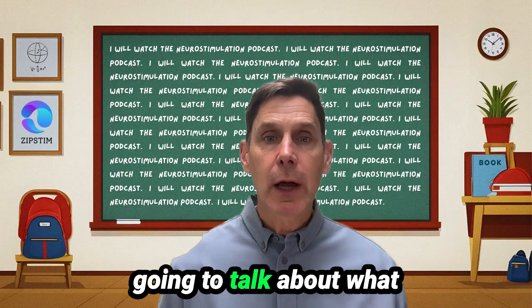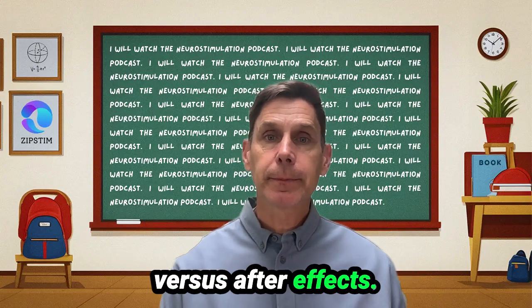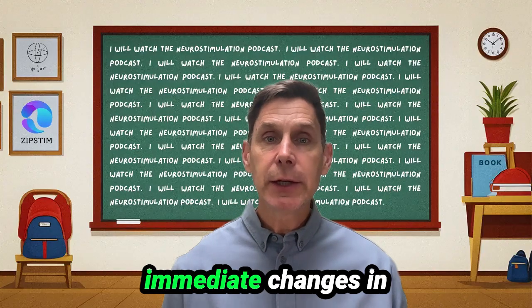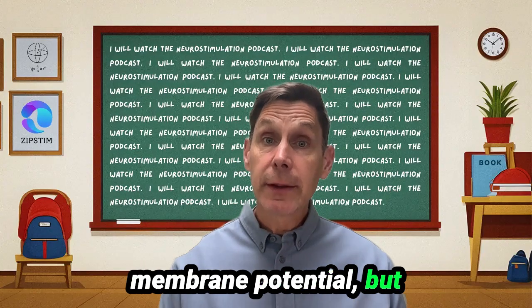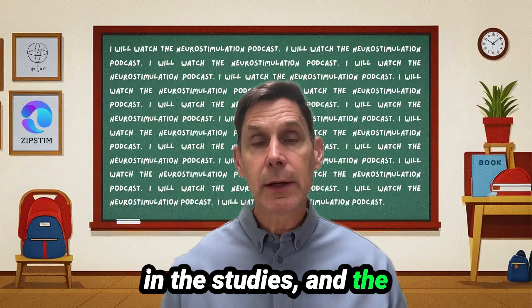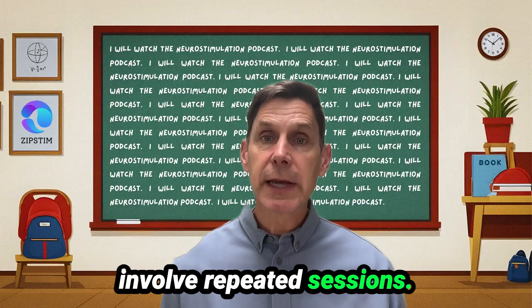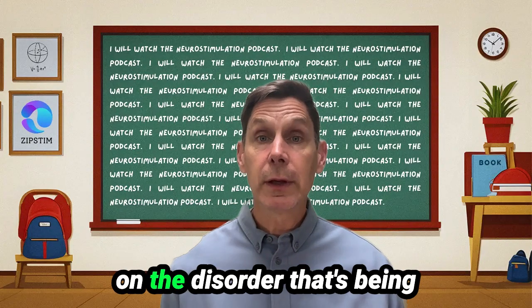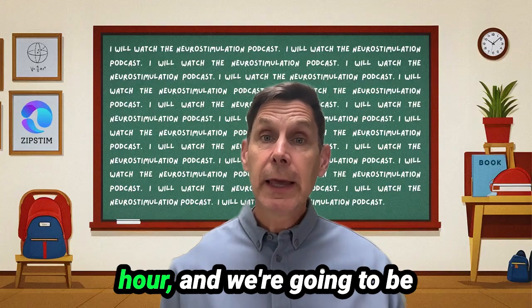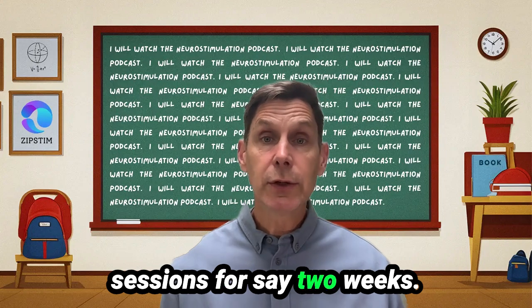For segment 4, we're going to talk about what happens over time, acutely versus after effects. Now, in a single tDCS session, there will be immediate changes in membrane potential, but there's more. tDCS, at least in the studies and the current clinical guidelines for therapeutic applications, involve repeated sessions. So each session, depending on the disorder that's being targeted, is going to last around half an hour, and we're going to be likely prescribing half-an-hour sessions for, say, 2 weeks.